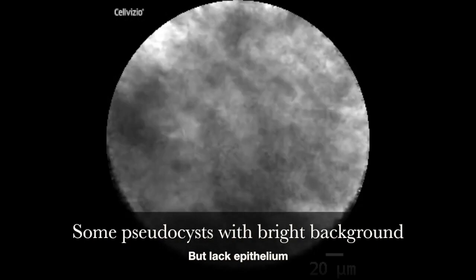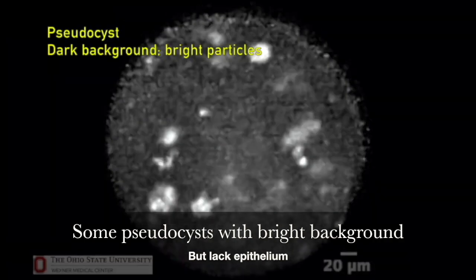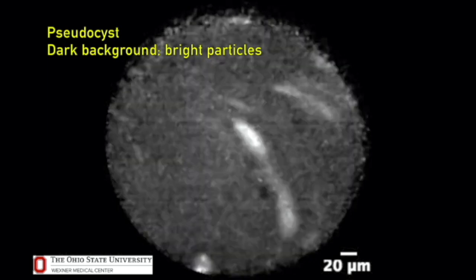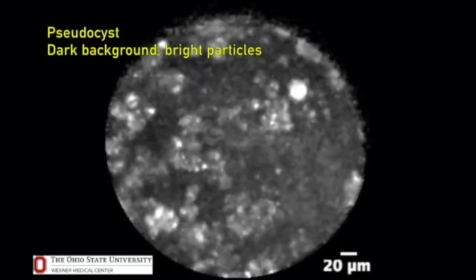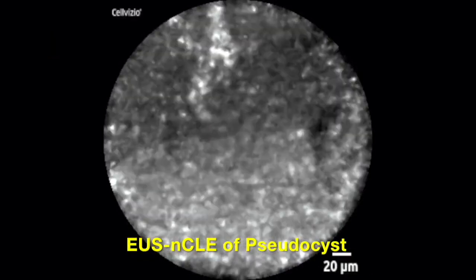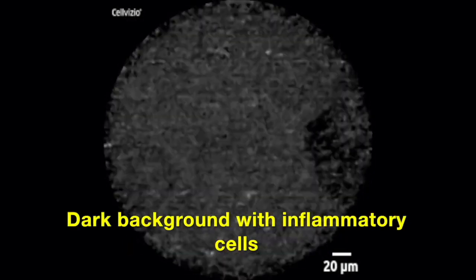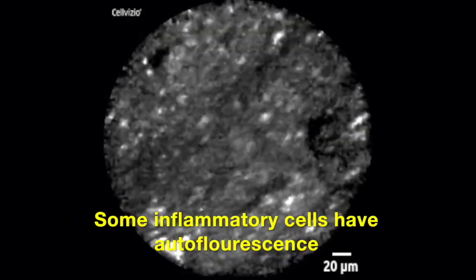The bright background is most likely due to the exposed part of the pancreas, typically when the needle is too deep. In this example, the cyst background is dark because of lack of blood supply. The bright particles are macrophages which have autofluorescence. In this last example, you see a very poor uptake of fluorescein with lack of blood vessels, and the background is featureless and dark with some autofluorescent inflammatory cells.